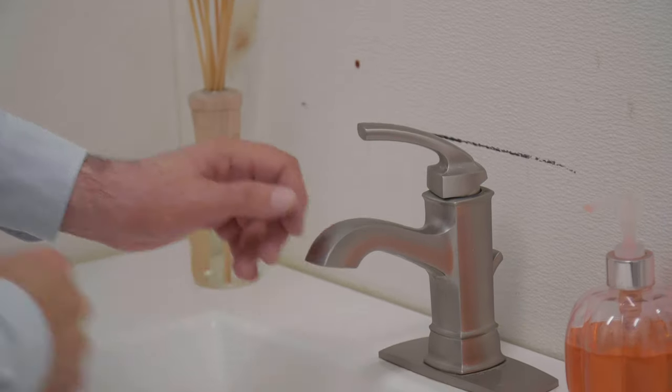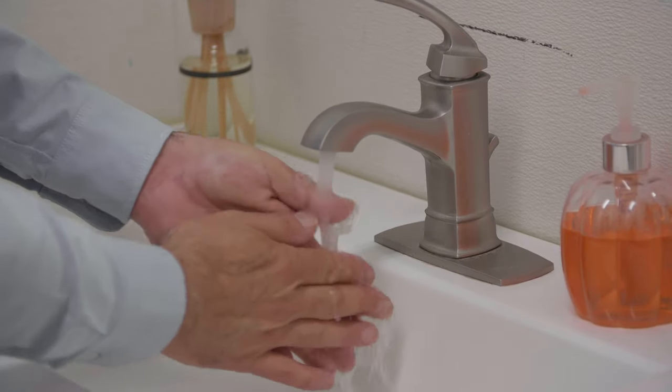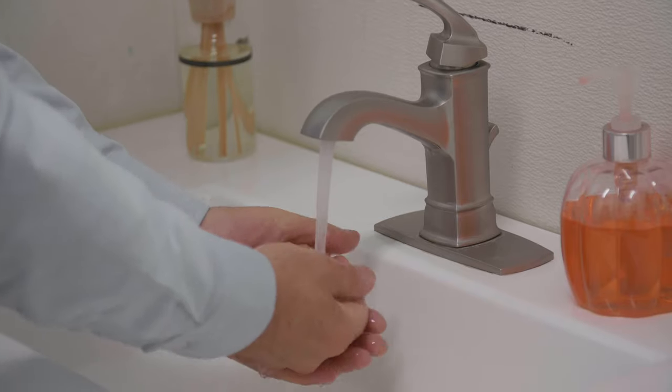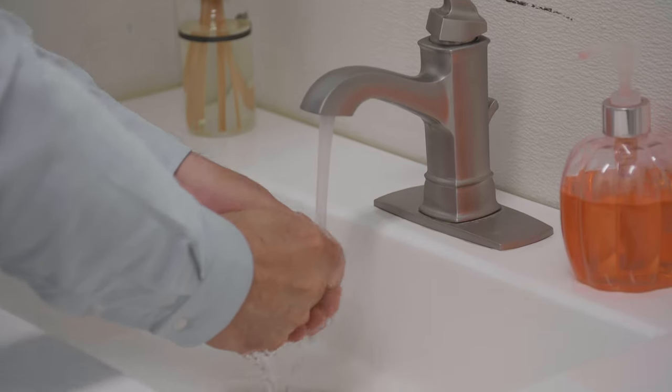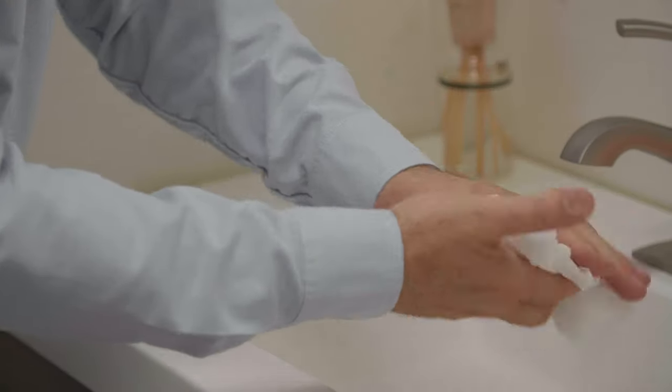For finger stick blood testing, increasing the flow of blood in the finger will help you capture a good drop of blood. Before you lance the finger, have the patient warm their hand by washing it in warm water or by using a hand warmer. Ensure that the patient's hand is dry prior to testing.